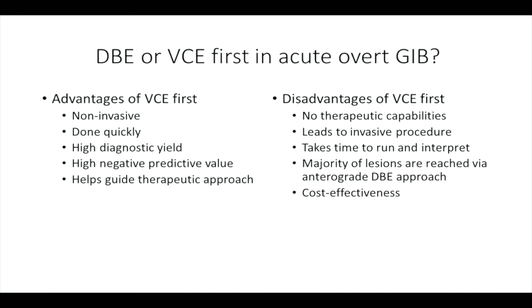Capsule obviously has no therapeutic capability. If it's positive, it will inevitably lead to an invasive procedure, even though it's not invasive. It does take time to run. You've got to have the patient swallow the capsule, got to run it, then you got to read the capsule, so that delays the intervention by sometimes a day or more.